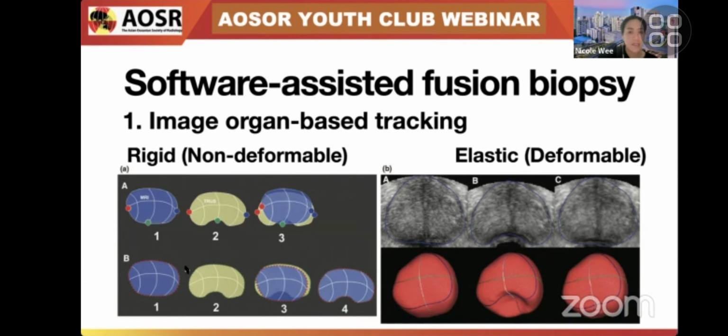And similarly, in the second row, multiple points have been placed around the MRI and TRUS prostate contours. The third image that you see in B3 is a rigid registration, which still lacks accuracy owing to the differences in prostate shape. And then the last image in B4 is when an algorithm is applied. So the use of elastic deformation with surface-based registration allows for deformation of the MRI prostate shape to produce a more accurate registration.